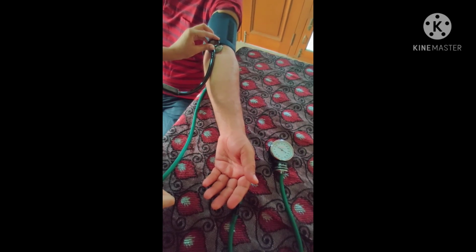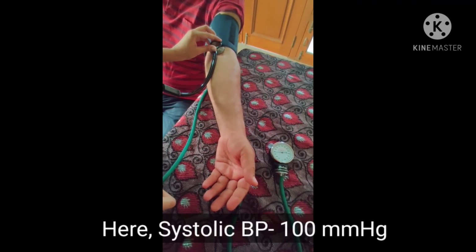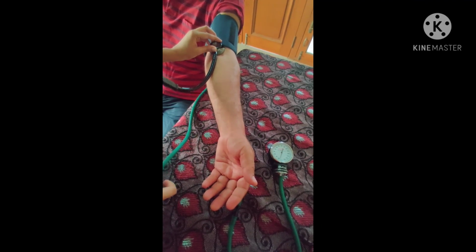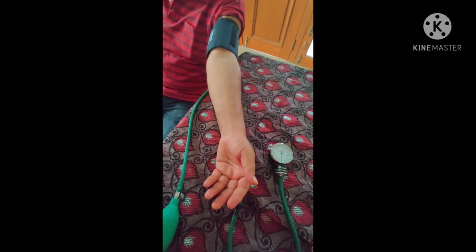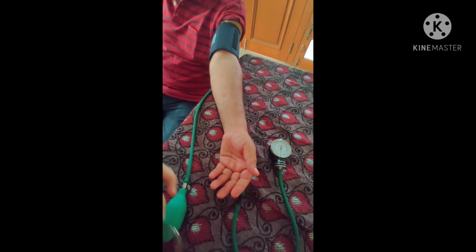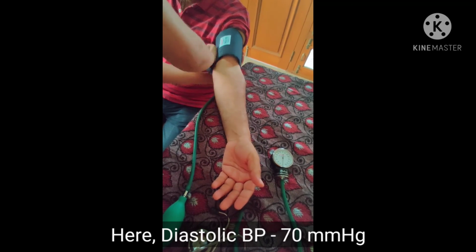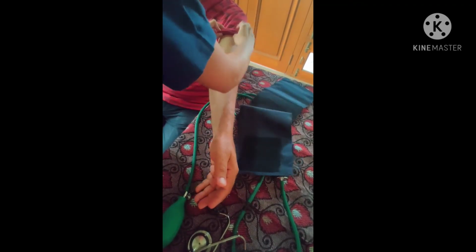The level at which you hear the sounds of at least 2 consecutive beats is the systolic pressure. Continue to deflate the cuff slowly until the sounds become muffled and disappear. The disappearance point, which is only a few mm Hg below the muffling point, provides the best estimate of diastolic pressure. After complete deflation of the cuff, remove the cuff comfortably.